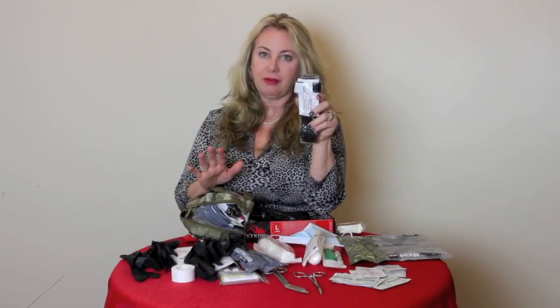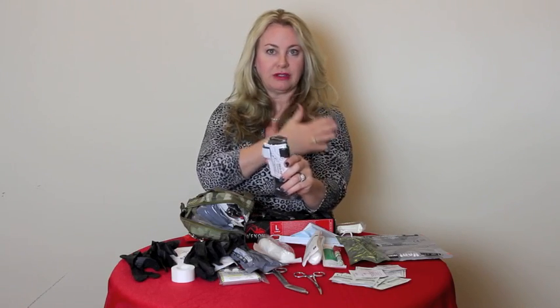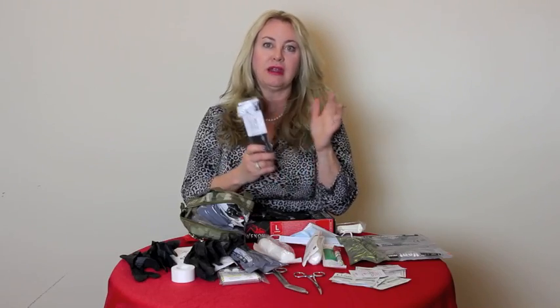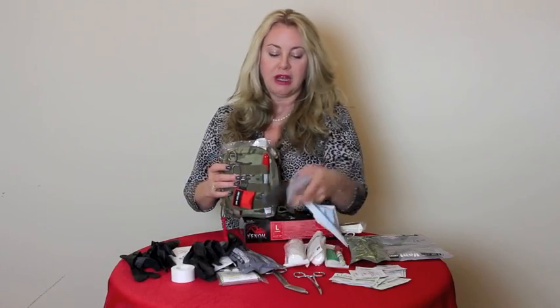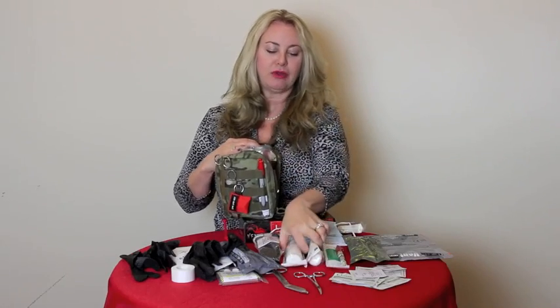You have to be careful about it, but you have to put it above the wound. Obviously not over the wound, that can damage it. But this is an excellent tourniquet, combat application tourniquet. You have one in here, and don't worry about the expiration dates on the tourniquets. There's no such thing.